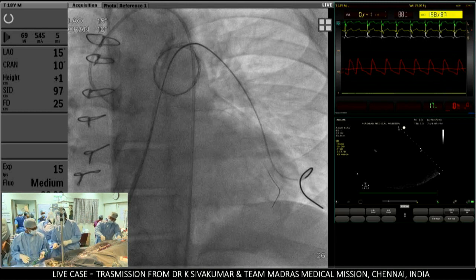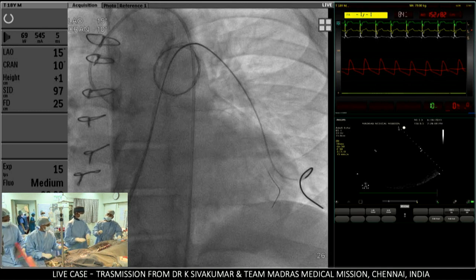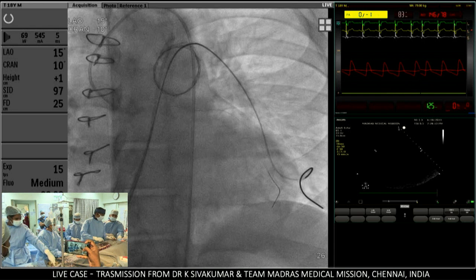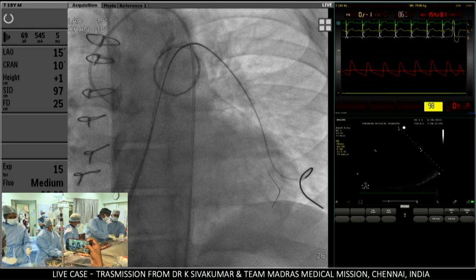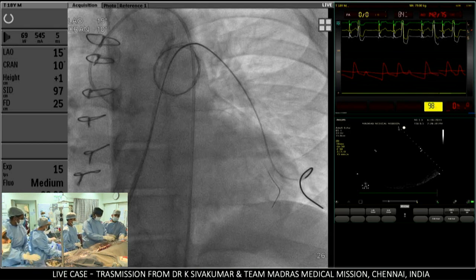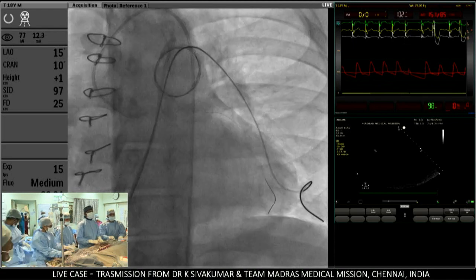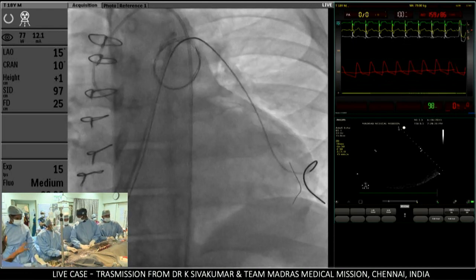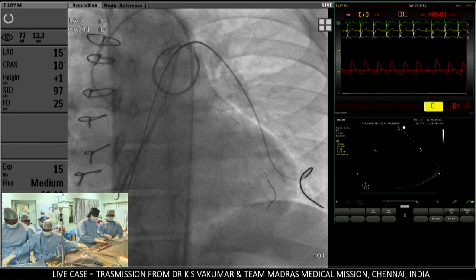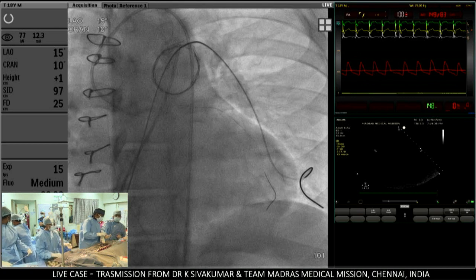It looks like it would take it and flare, and there's probably enough tissue to get a seal, particularly because you're 26 millimeter with 3 millimeters extra. Yeah, that's a good option as well. I think 29 might be a bit easier, and they're huge pulmonary arteries. Any other differences of opinion? Okay. See, what I'm going to do is something. Thomas?